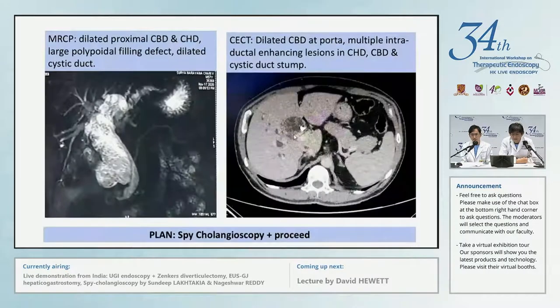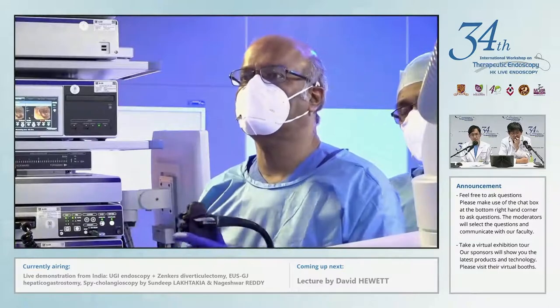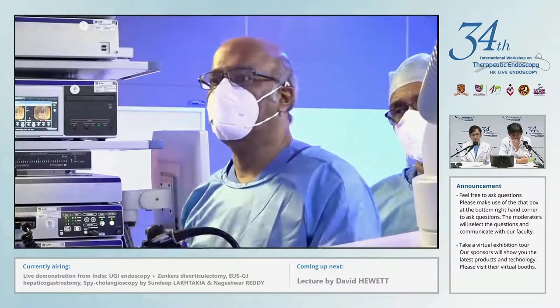So to investigate him, when we looked at his MRCP and CT scan, MRCP showed a dilated CBD and CHD with some filling defects, not classic of stones, and the CBD also was dilated predominantly to the porta with multiple intraductal enhancing lesions in the CHD, CBD, and the cystic duct stump. So a diagnosis of a potential tumor was made intraductally, and we thought this evening we'll try and see what is actually inside the bile duct by doing a cholangioscopy.